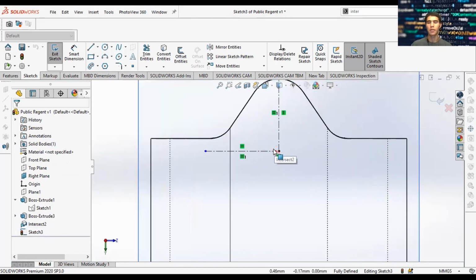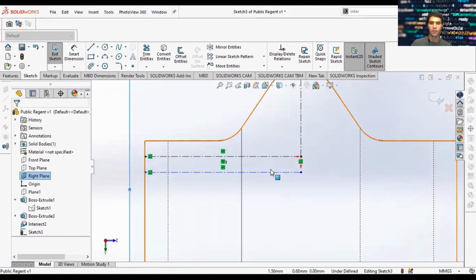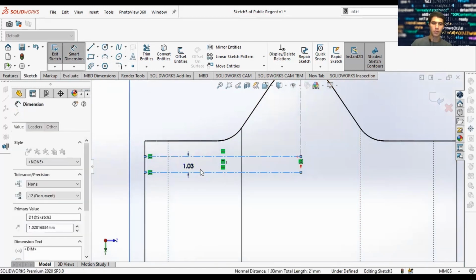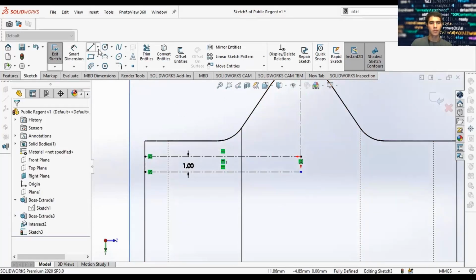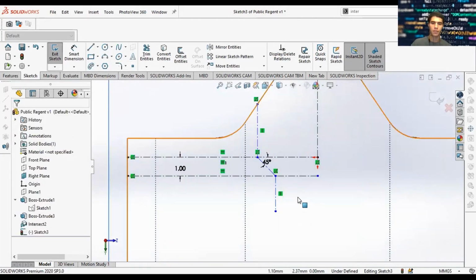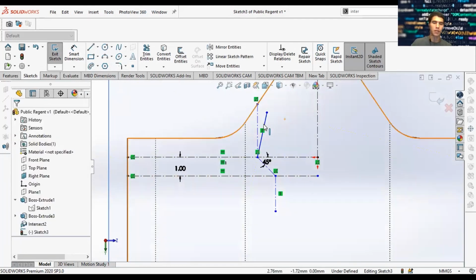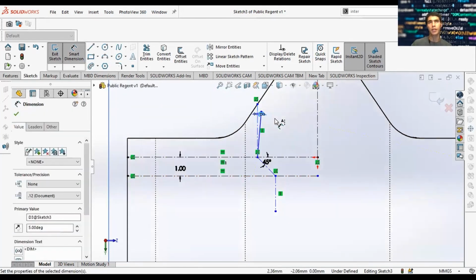So now what we'll do is we're going to draw the pivot. The way these bi-leaflets work is that they need to pivot on something. So there's some grooves within the mechanical heart valve that allows it to pivot. And if you remember, the pivot angle is 85 degrees, correct? 85 degrees. So what we'll do is we'll draw and put this here. Set this equal to 1 offset. And now add another center line vertically. So this is a reference line, and we'll be using this since we're going to draw a 5-degree angle offset from this reference line. Since it's 90 minus 85, so it's just 5.